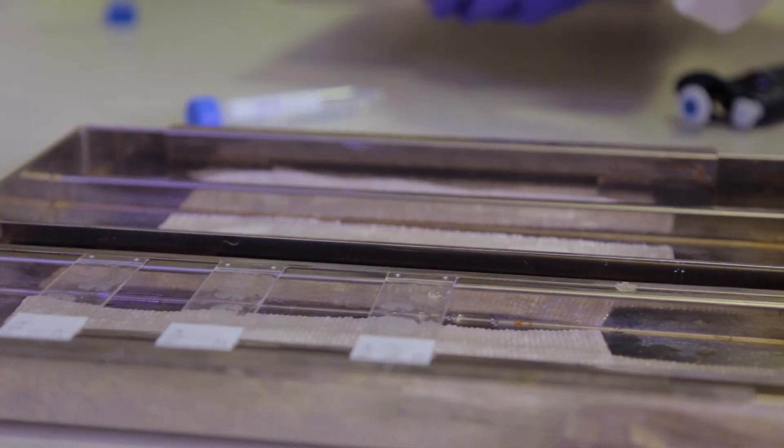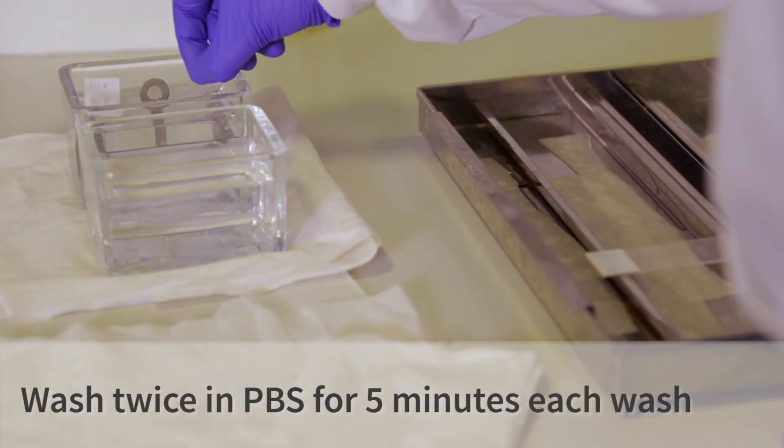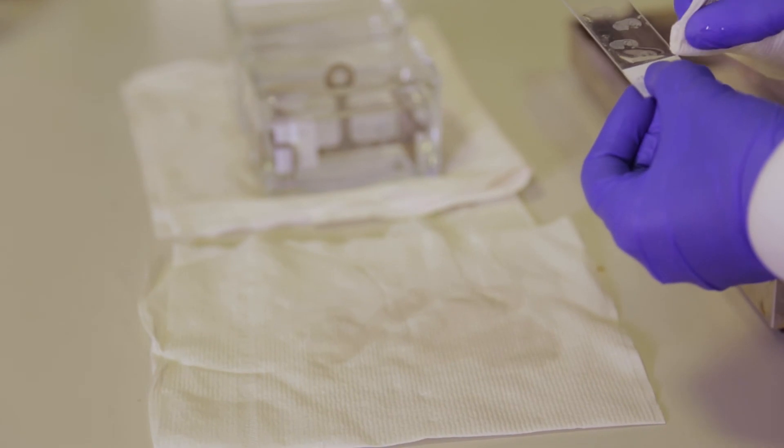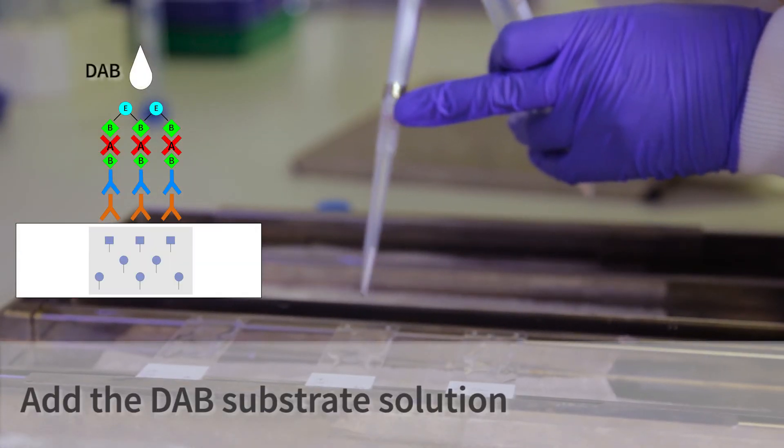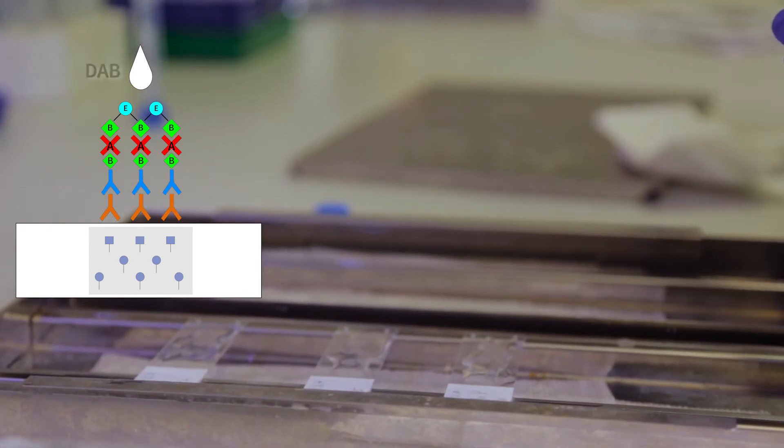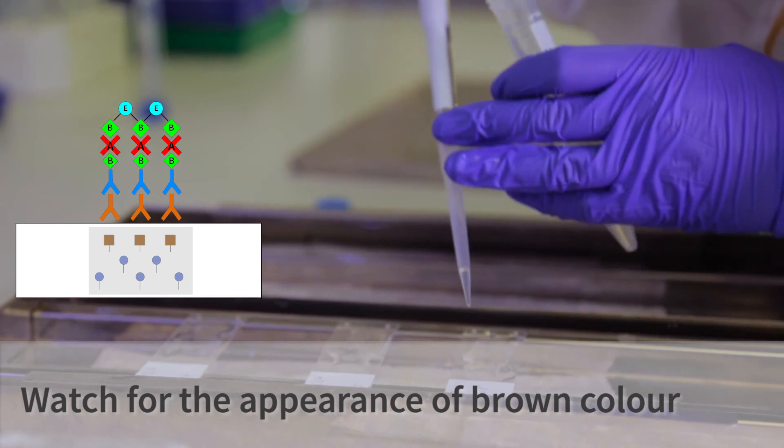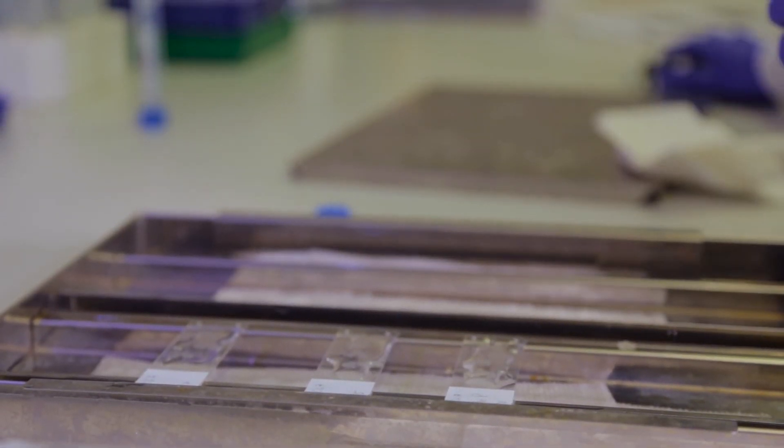The next step is the addition of the substrate. For this, we again rinse the slides in PBS twice for five minutes. We then dry the back and sides and pipette on the DAB solution. Watch the slides carefully after you pipette the DAB solution on. The tissue should start to turn brown. DAB is extremely toxic, so take care whilst using it and treat any lab equipment with bleach afterwards.